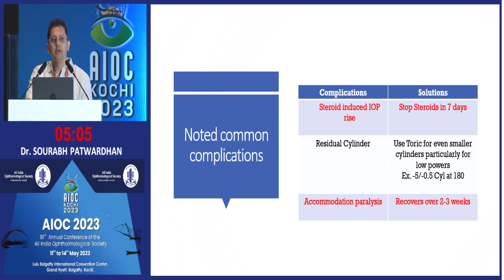Same is true during intraoperative maneuvers. Don't push the central part of the IPCL back on the anterior lens surface. That may leave these kind of changes for some period post-operatively.